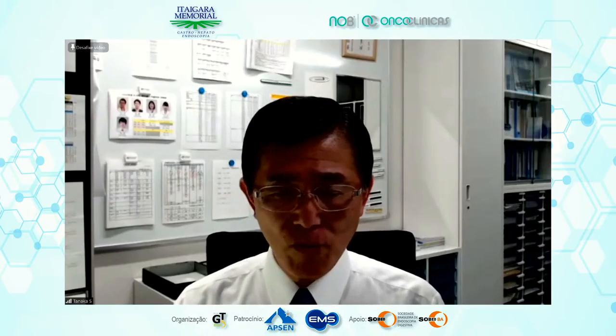It is also needed to determine the therapeutic strategy. If the lesion is carcinoma, we should do EMR, not polypectomy. If carcinoma, we have to resect en bloc, so EMR or ESD. But benign adenoma can be treated by piecemeal EMR. Like this, magnification is becoming essential.